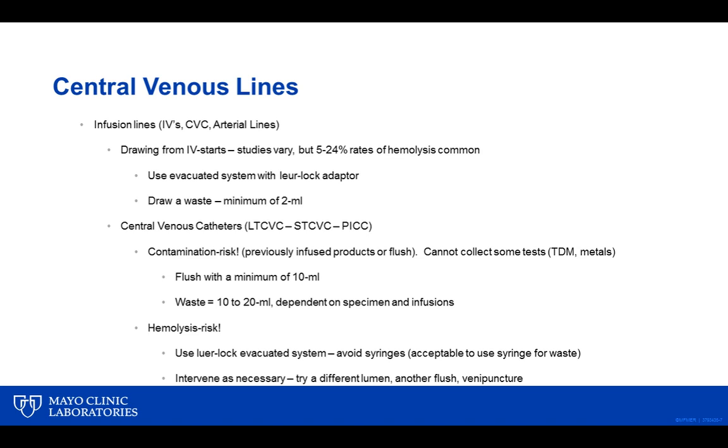The first thing we look at there is drawing from IV starts. I know that's a very common practice. I also know from past experiences in presentations, questions that were raised, the concern with hemolysis, and that is significant. There's been many studies done. You can certainly easily access them by Googling them, and you will find that there is a 5 to 20+% rate of hemolysis that occurs with IV starts.